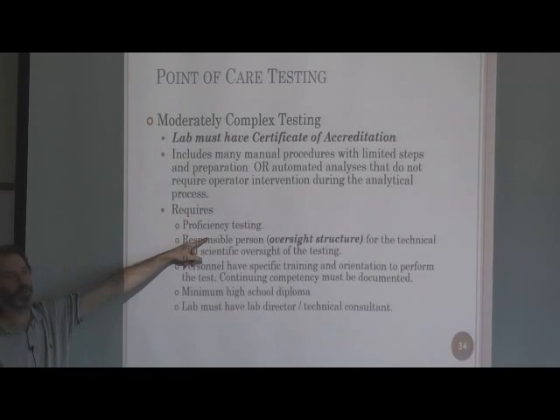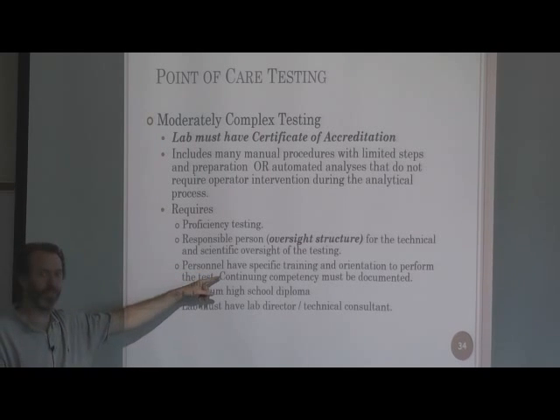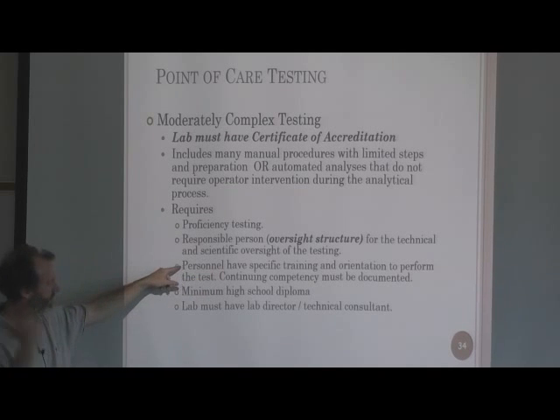We talked about that a lot, right? There's CAP, which is one of the places you can get proficiency testing. There's another one on here that I forget the name of, and I always do. I looked it up again today, and I forgot it already. CAP is the College of American Pathologists. But then the other one, you'll see it when it pops up.